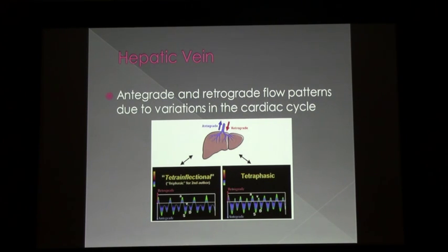Yes, hepatopedal flow is antegrade. But they're like, what is this antegrade? Which direction is flow? That's why I always just say it, like we don't say superficial femoral vein anymore. You know why that is? Because people think it's a superficial vein when it's a deep vein, so that's why we don't say it. So if you're going to put that in the chart, I would just say flow towards the liver.